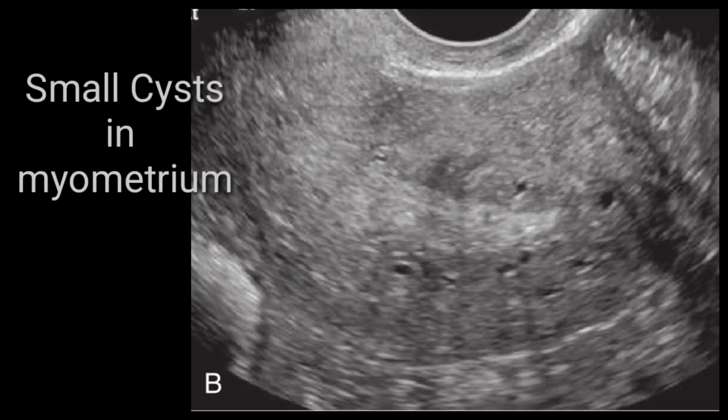Again, I would mention the criteria that it should be 2.5 to 3 millimeters away from the myometrio-endometrial interface, which you can appreciate here. Endometrium is in the center, echogenic endometrium, and it shows secretory phase changes, but the myometrium shows small multiple cystic spaces because of endometrial deposits, and this is an example of adenomyosis.